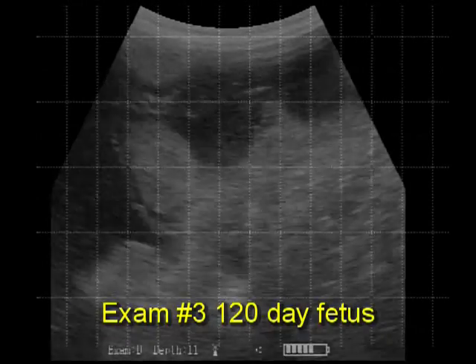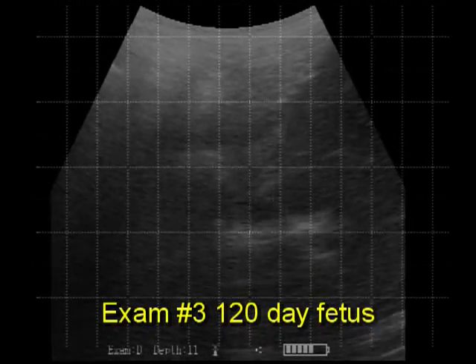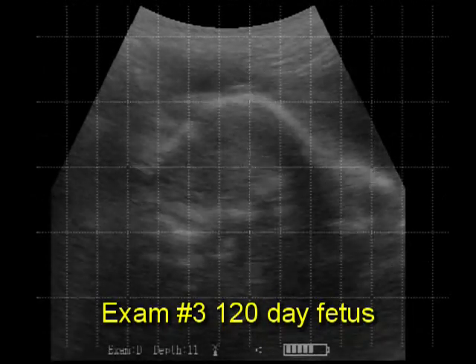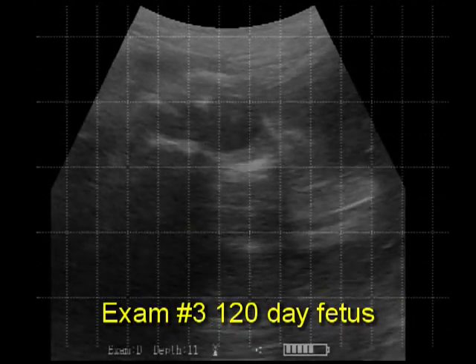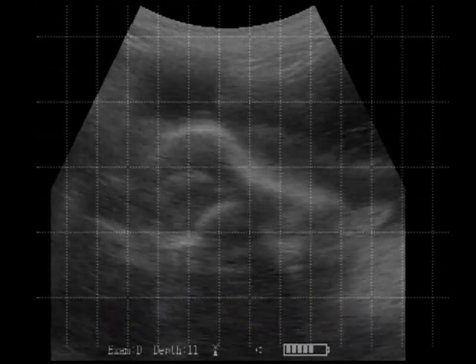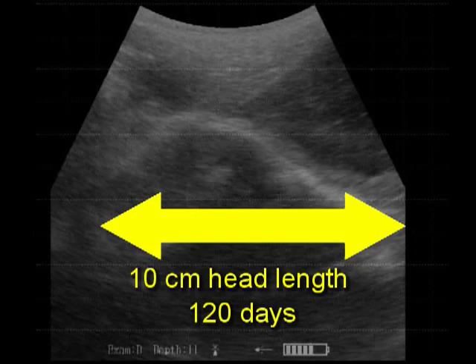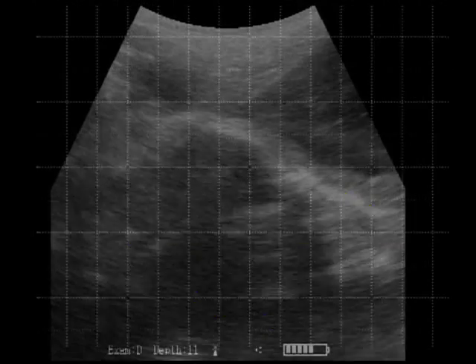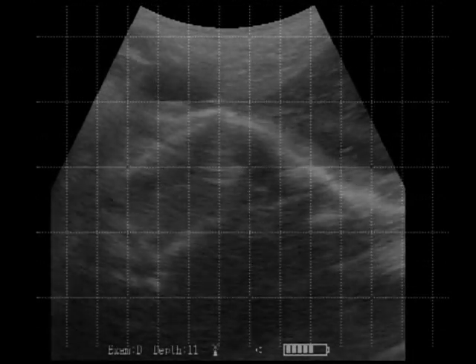Exam 3 is a 120-day fetus. Here we'll try to use head length to approximate the age. The screen is 12.5 centimeters at the widest point. You can see here we're approximately 10 centimeters for 120 days.